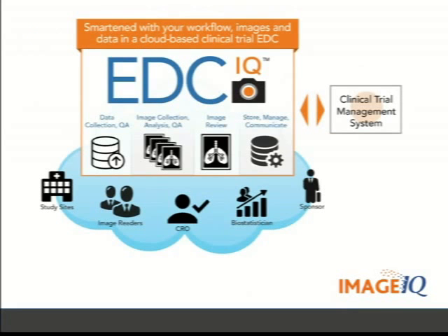So we thought we'd talk a little bit about what makes an EDC an image-enabled EDC. The essence of it is pretty simple. You all know what an EDC is all about, right? It's electronic data capture somewhere in your system. But the key thing that makes an EDC an imaging EDC is that it integrates the images as soon as possible in the process and allows those images to stay with their data and with the people managing them the whole way through. It's a consistent package that goes through, right?